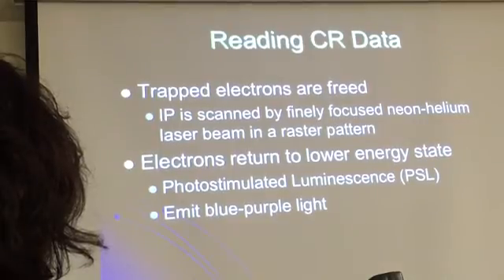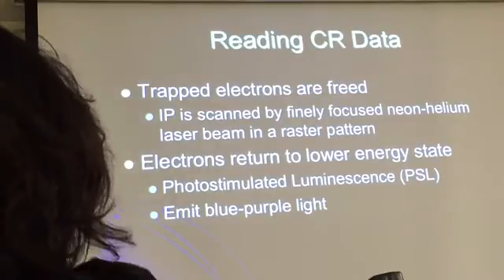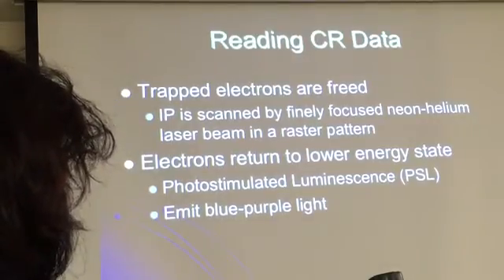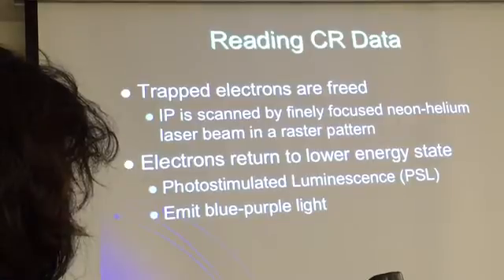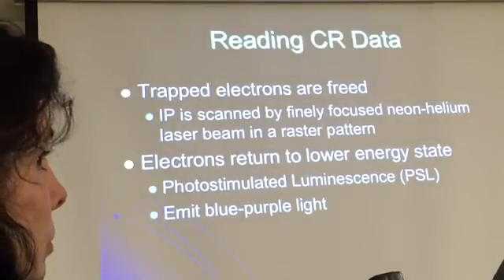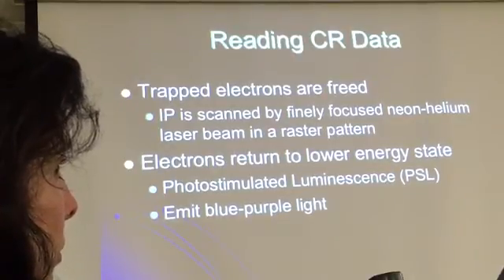What was the significance of the light blue inside the CR plate? Does that have any significance? This is what I've been saying. When you expose the film, you're done, and then you bring it into a reader. That's what I'm describing right now. You put it in there, this thing opens.